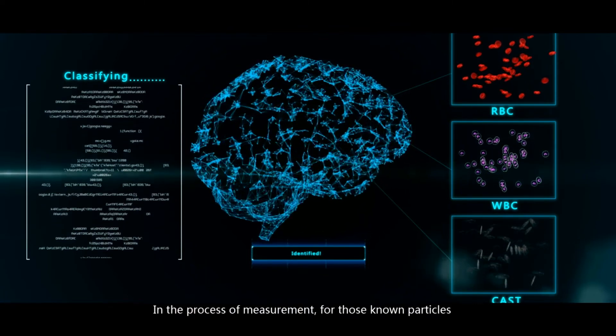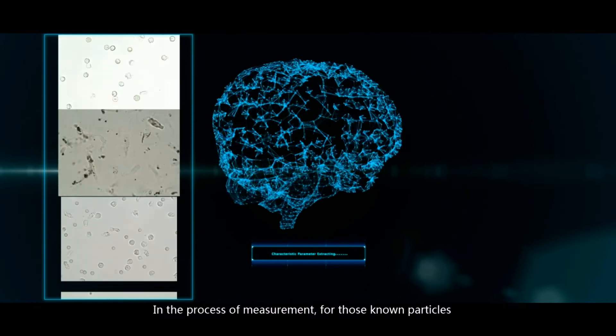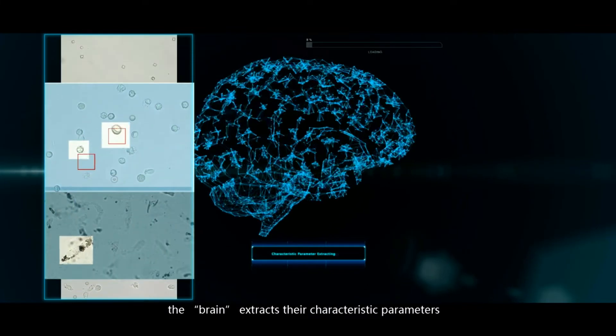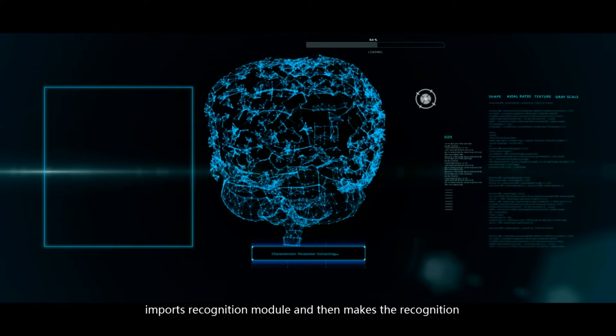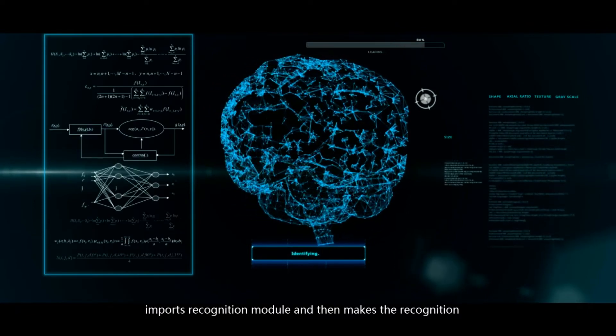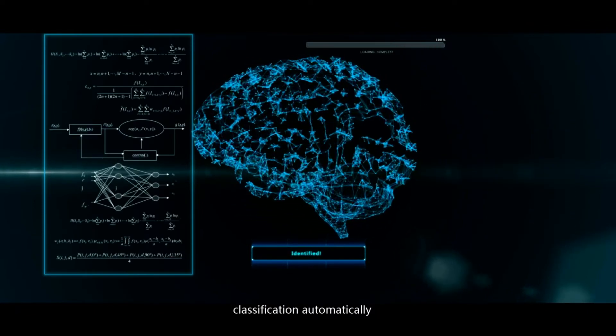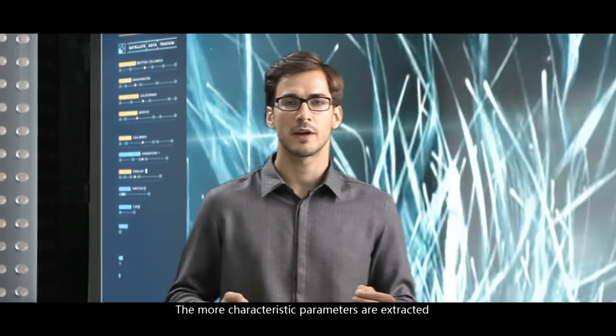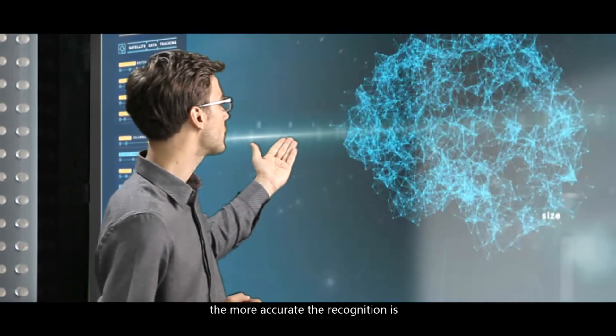In the process of measurement, for those known particles, the brain extracts their characteristic parameters, imports recognition module, and then makes the recognition classification automatically. The more characteristic parameters are extracted, the more accurate the recognition is.